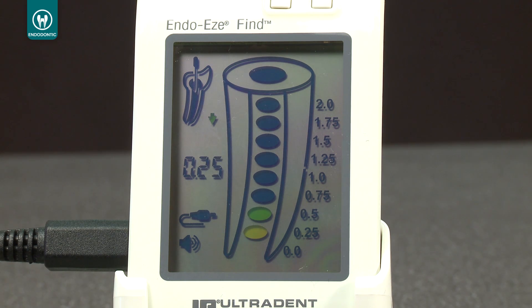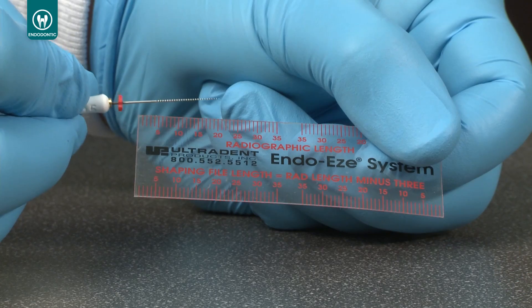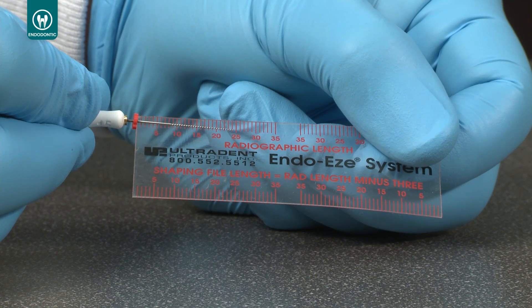Numerical readings appear under the tooth icon. When the Find unit returns a numerical reading of 0.0, accompanied by a constant audio tone and the first red dot has appeared in the schematic, the tip of the file is at the apical foramen. Use cotton pliers to push the stopper down to the reference point. The working length for the canal can now be established.